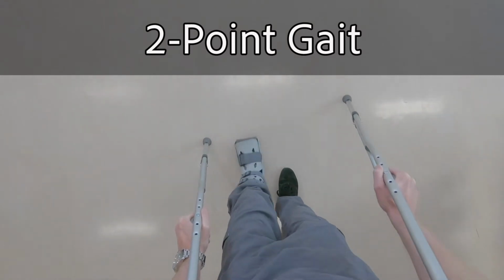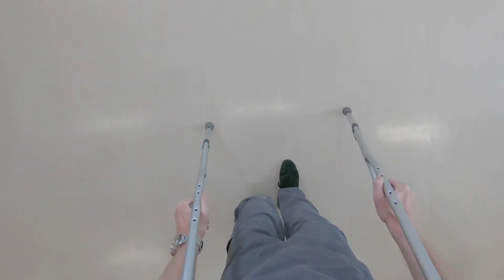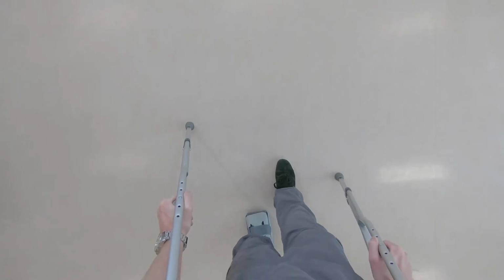For a 2-point gait, advance right crutch and left foot at the same time, then left crutch and right foot at the same time.